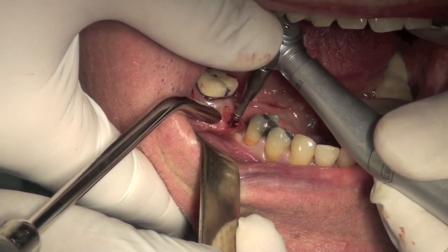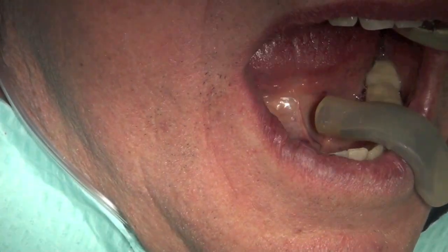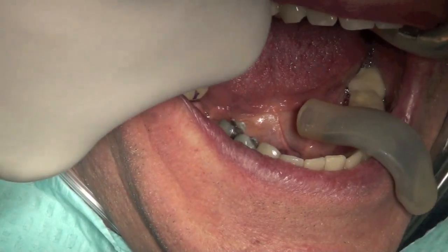Feel that? Open. Open big. Get more numb.